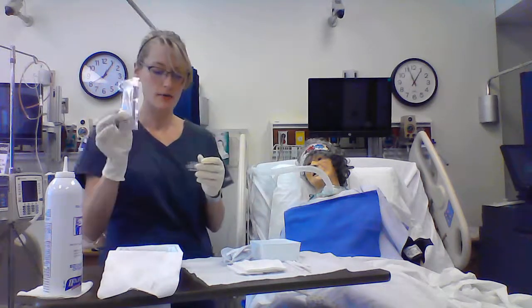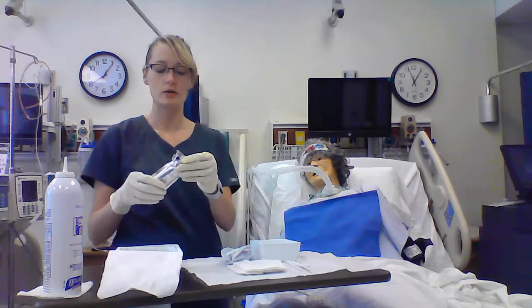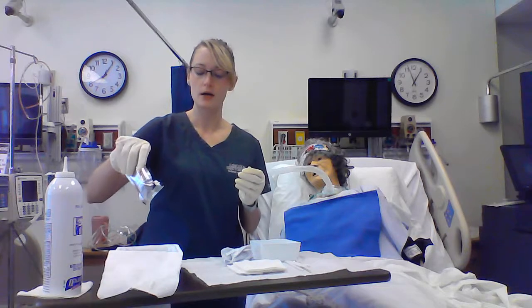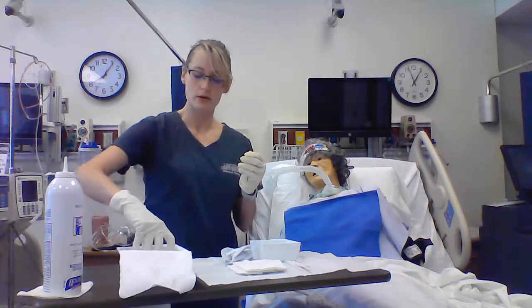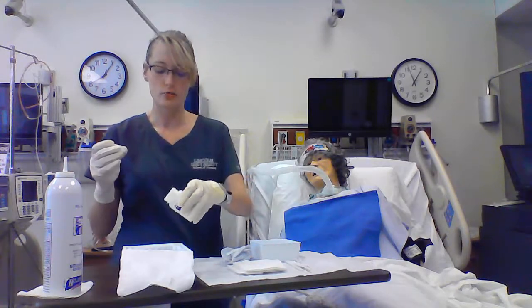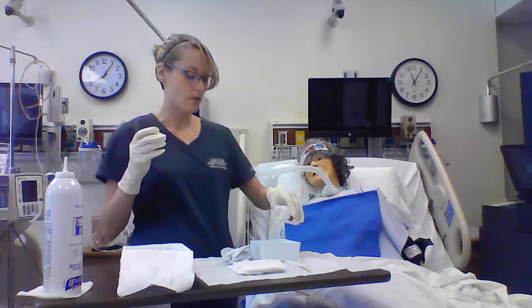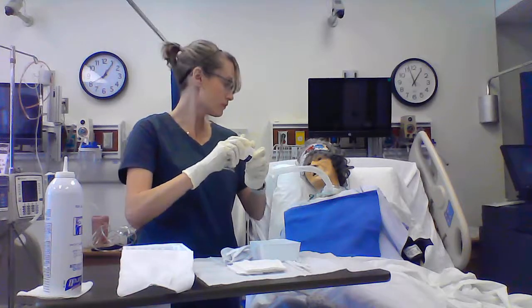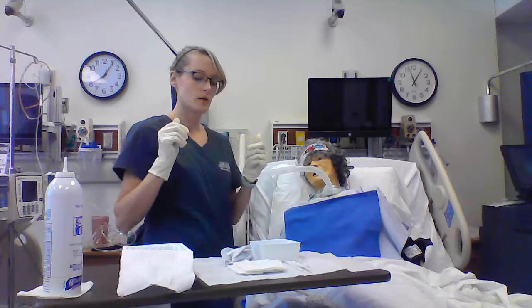Okay, so in these kits you have hydrogen peroxide. I'm going to choose a container to put that in so that we can clean her cannula. So tear this open, put your hydrogen peroxide in a container. This package also comes with sterile normal saline. So I want to mix that half and half with my hydrogen peroxide, and then use the other half of the bottle to rinse. And throw that container away.